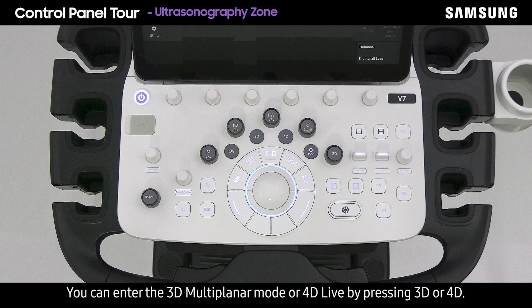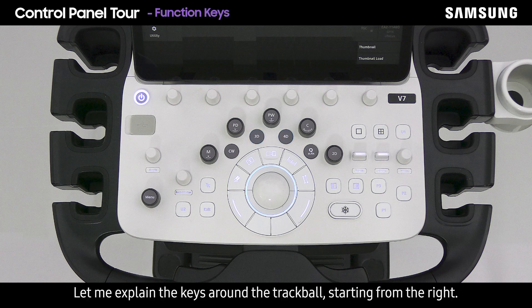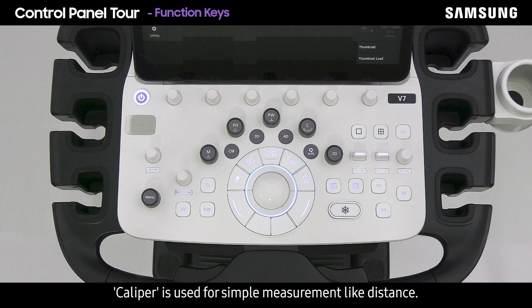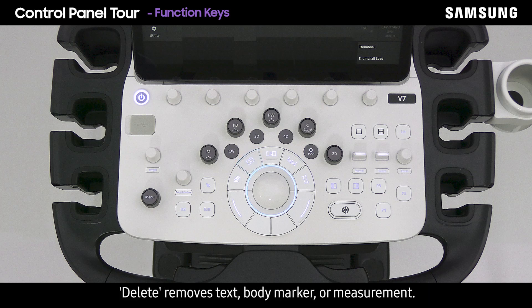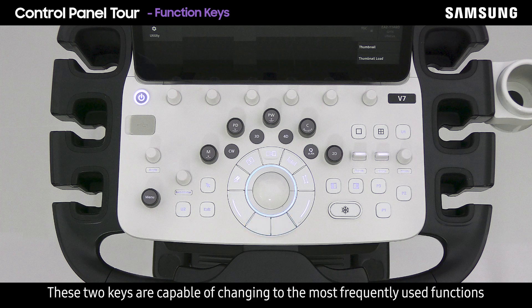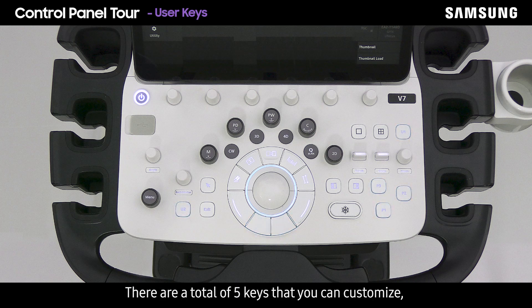M, PD, PW, C, and 2D modes can be accessed by pressing the respective knobs, and the gain can be adjusted for each mode by turning the knob. Around the trackball: caliper is used for simple measurements like distance; measure includes more various measurement items whose results appear on the report page; annotation is for text insertion; delete removes text, body marker, or measurement — a long press deletes all items. There are five customizable keys total: three peripheral keys and two user keys, each assignable to a specific function.